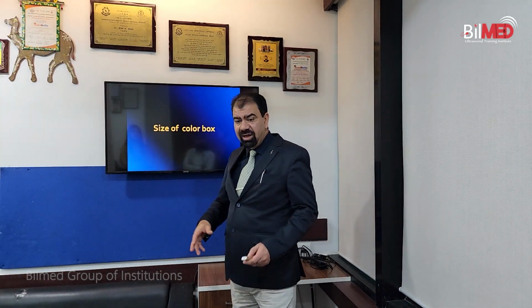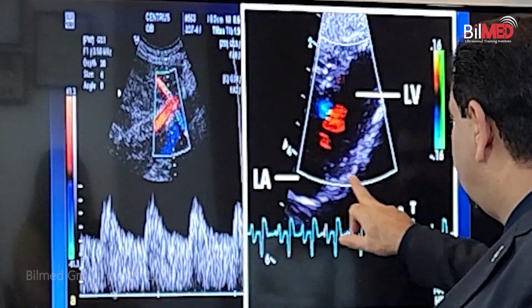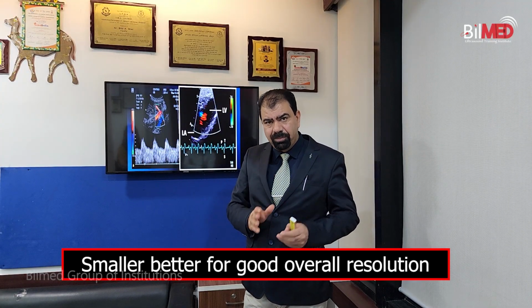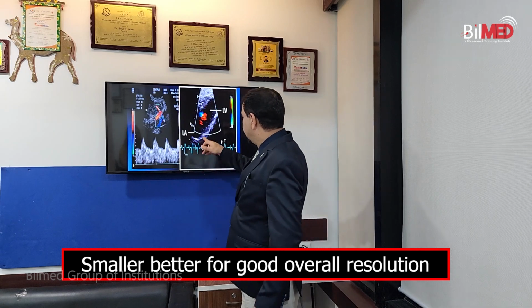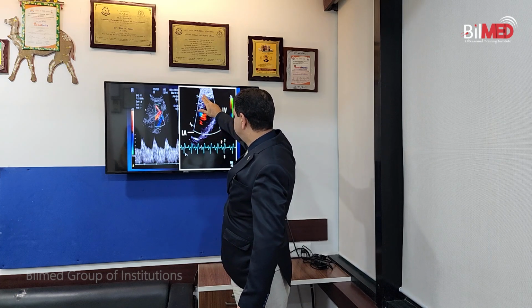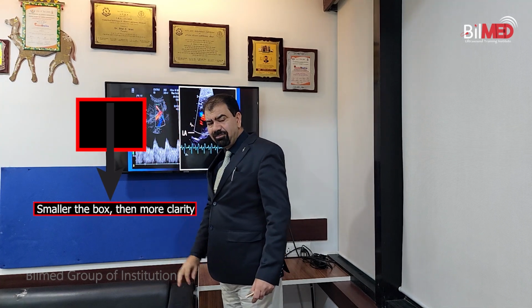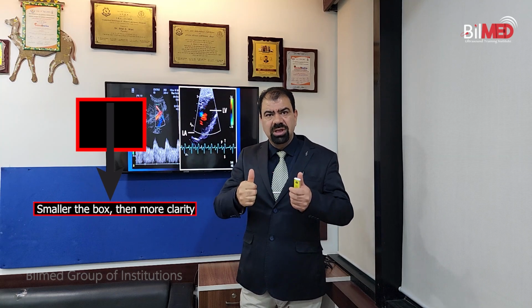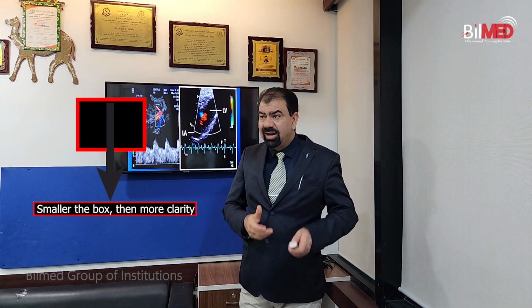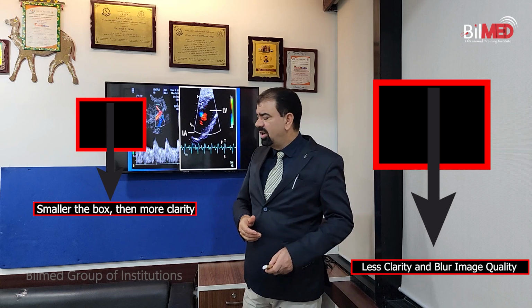Then the size of the color box: the overall color box should not be big. You have to put a small color box. Smaller is better for the overall resolution. Now here I am interested in this area only. What is the use of putting this much color box when my area is very small? So put a smaller color box. The smaller the box, the more the clarity of the color. The bigger the box, the lesser the resolution of the overall image. So keep your color box as small as possible.